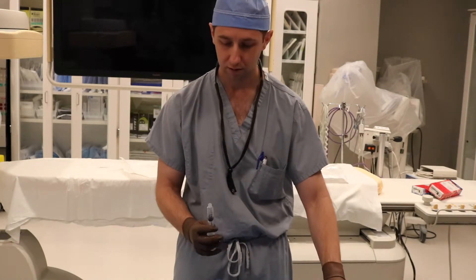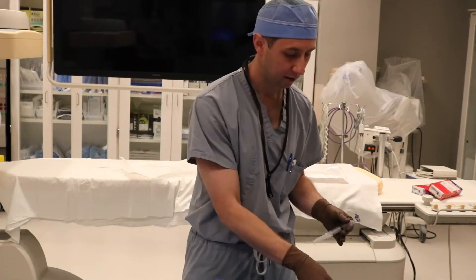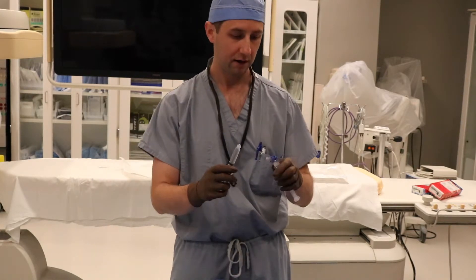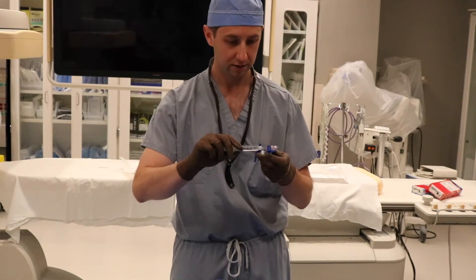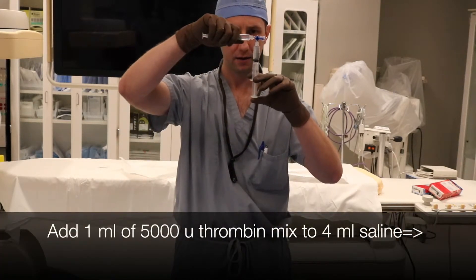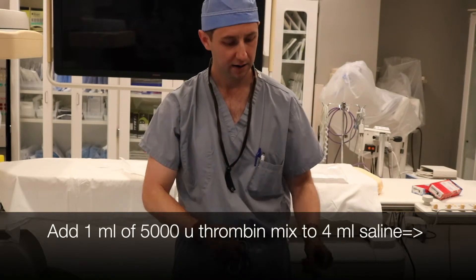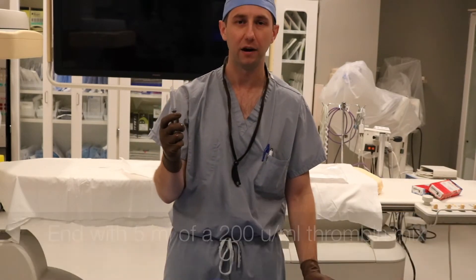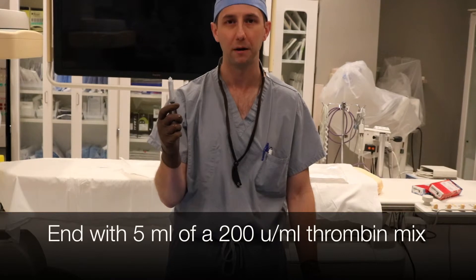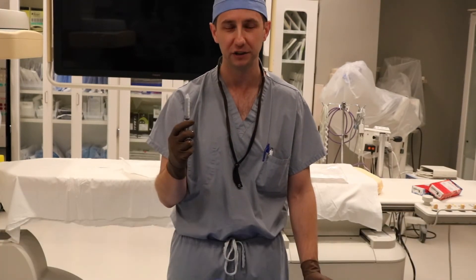Then you can take 4 or 5 mLs of saline in a 5 cc syringe and basically just add 1 mL of thrombin to the mix. Now in the 5 cc syringe you should have 200 units of thrombin per mL, and that's plenty for what you need to do in terms of pseudoaneurysm injection.